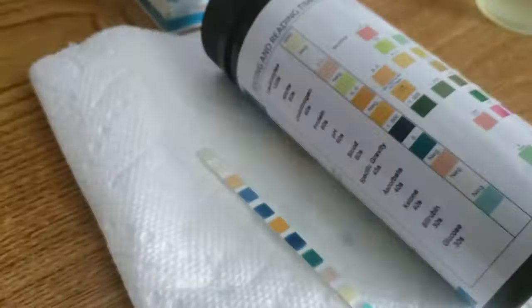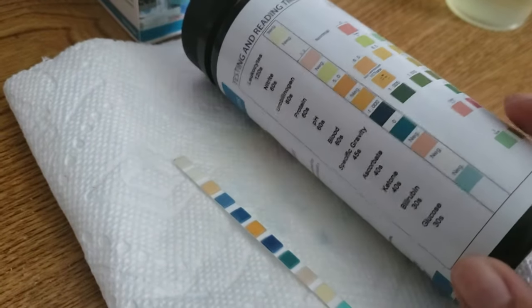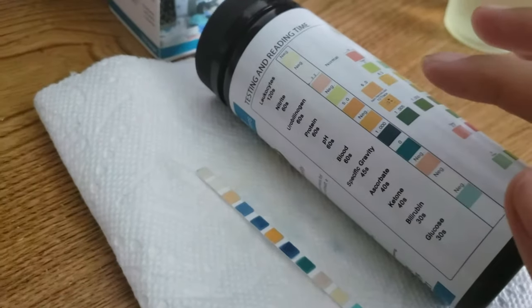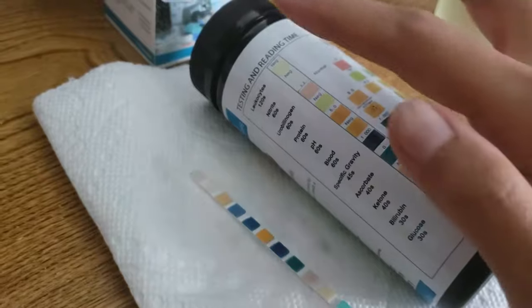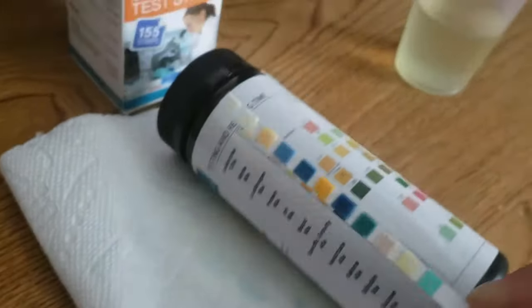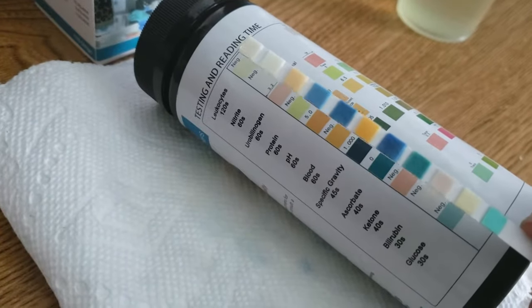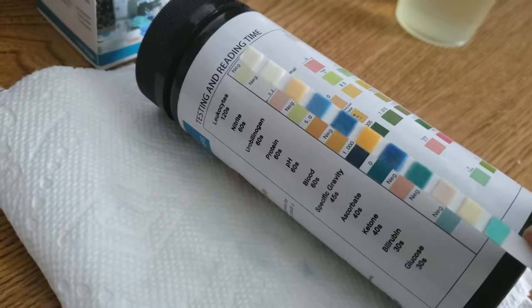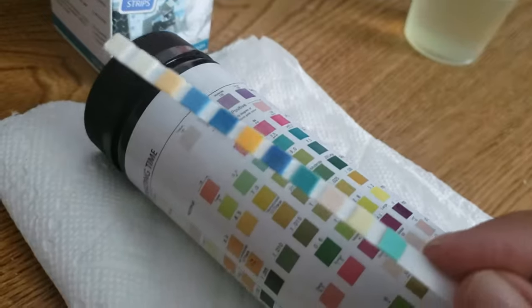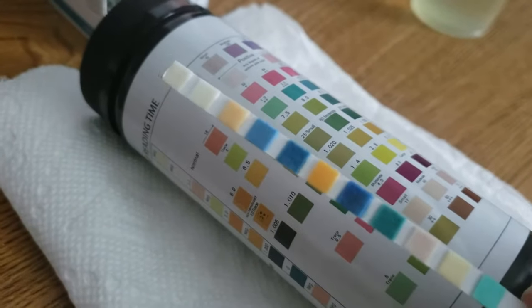So we're going to go ahead and start looking at our results. You can read these either by comparing your results as the seconds go by, or you can just wait two minutes and then read your entire strip all at once. What you want to do is compare the color on your strip to the color on this color chart and just look to see which color on the chart is the closest match to the color on your strip.